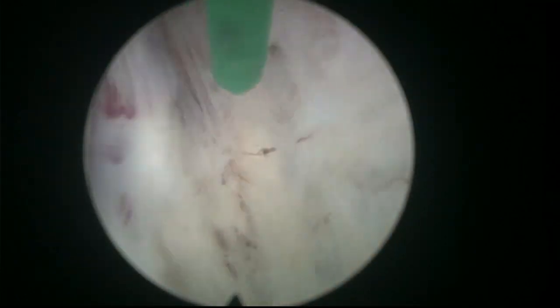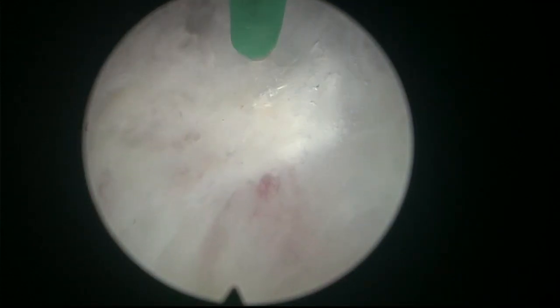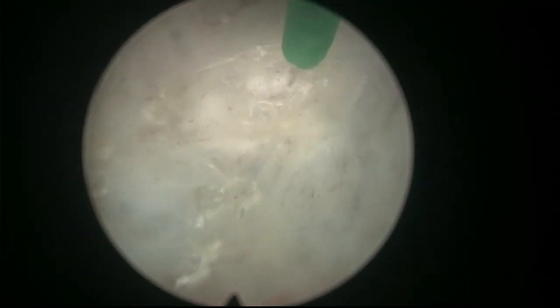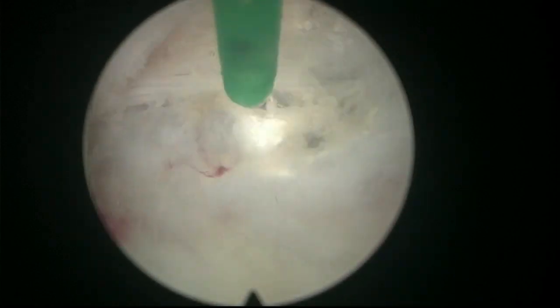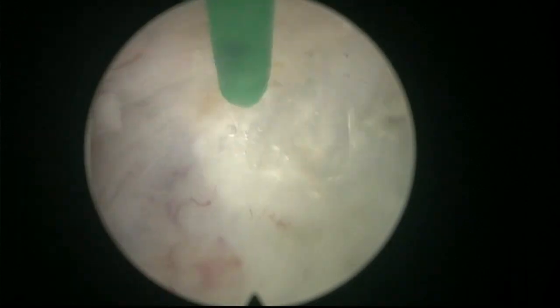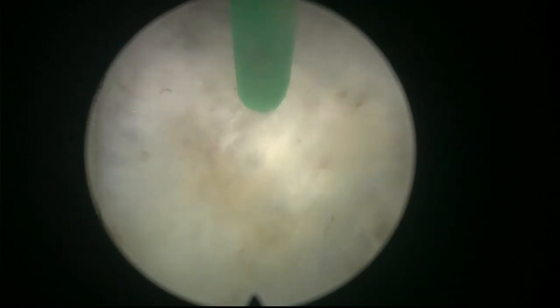Here we are. Let's see if we enter that beautiful plane we found before here. And you see, it more or less coincides with the plane we were following down here, although the quality of the plane has changed significantly. Now, to me this is all abnormal, so we have to take it out. But sometimes you cannot tell if you are taking some of the peripheral zone with the adenoma. It looks pretty good to me as it's progressing.